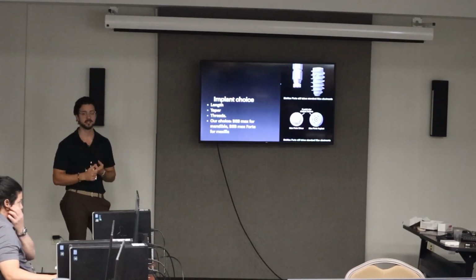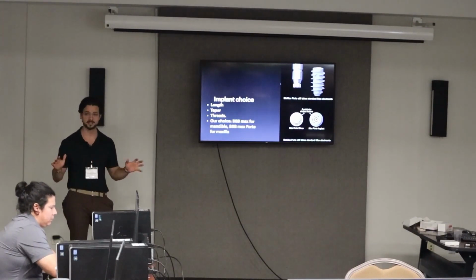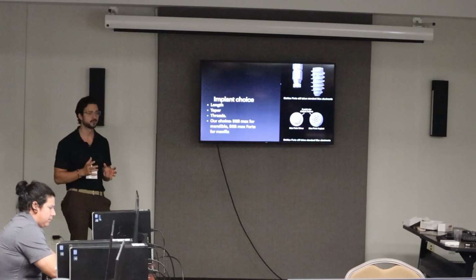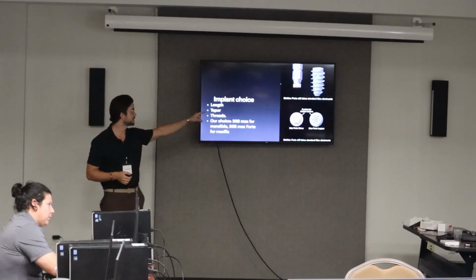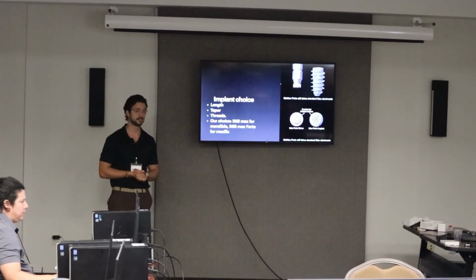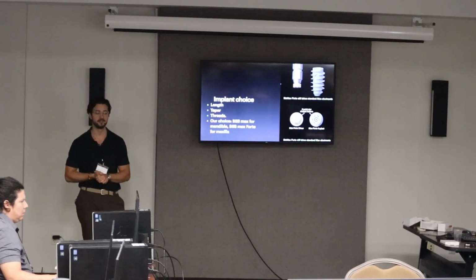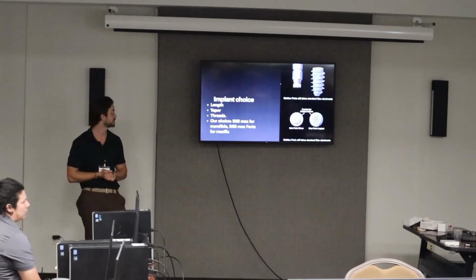We use the Forte in the maxilla where there's very spongy bone. And the Blue Sky Bio Max, that's the standard Blue Sky Bio implant, we use for a lot of mandibular surgeries because there's a lot of cortical bone. You're not worried as much about achieving primary stability. But in the maxilla, we find these aggressive threads compress bone enough so you can load the same day. A lot of the times that we had failure is because we did not have an aggressive enough implant up there. You get brave sometimes with the torque values because cross arch stability is a thing, but it's only a thing up to a certain cross arch stability sum value of torque.